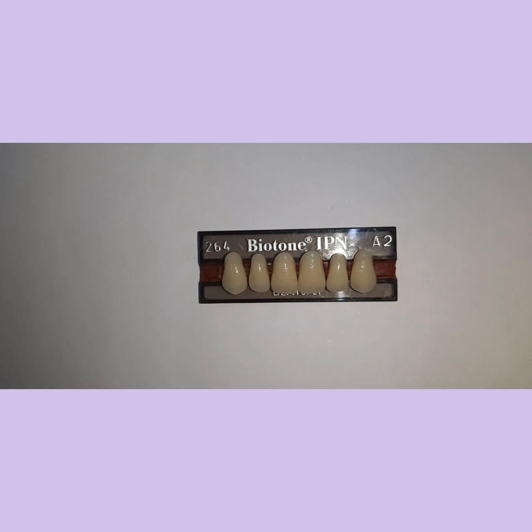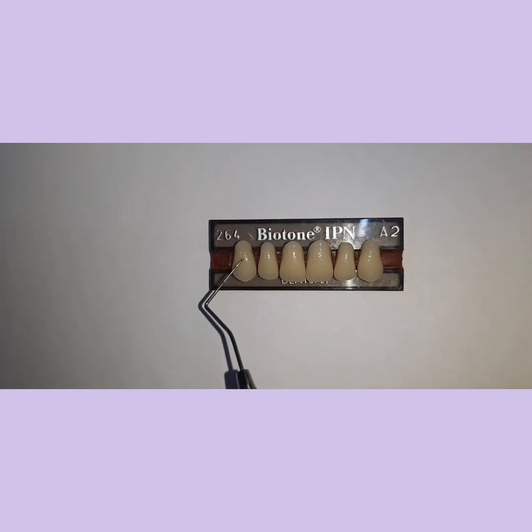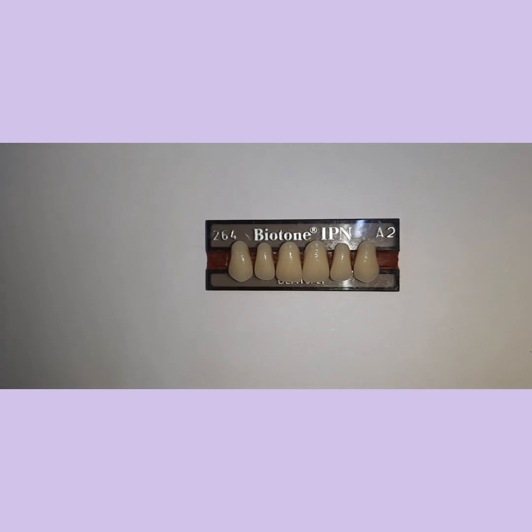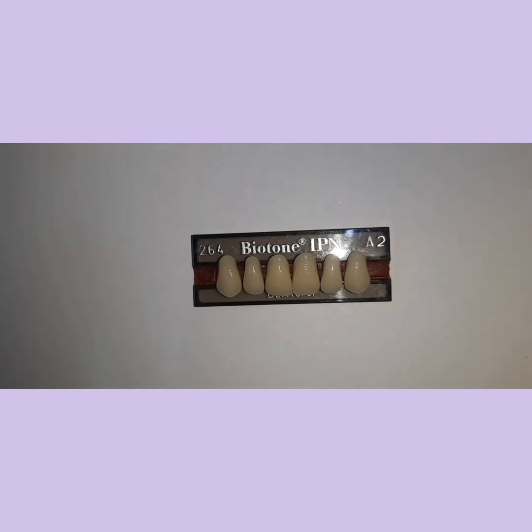There is a transition of shade from central incisors to the canine. Central incisors are usually lighter in comparison to the canine, so the canine is slightly darker in shade. Shade selection will also depend on sex, personality and age. That is according to the dentogenic concept, which I'll take up later.